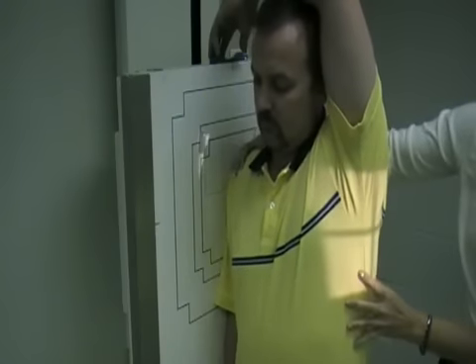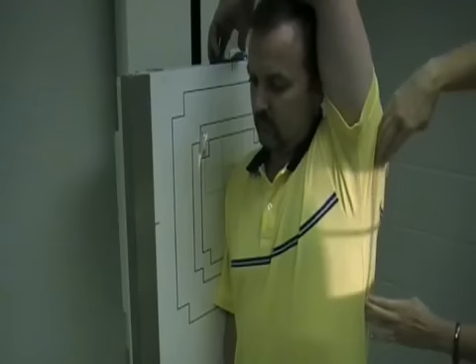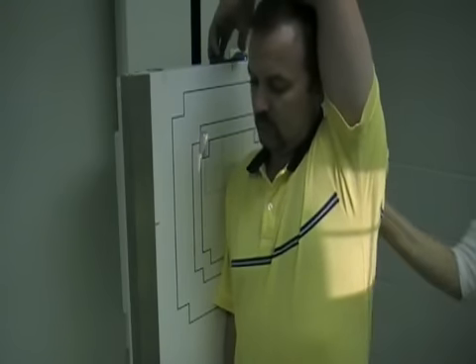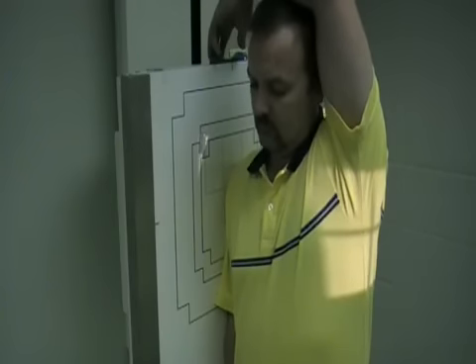So just get your patient lined up so that your central ray is going to be hitting mid-coronal. Make sure the patient's good and straight and lateral for this. Okay, now for this projection, the patient can either take deep inspiration for the exposure, or they can do a breathing method throughout the exposure. So this is our transthoracic Lawrence method.